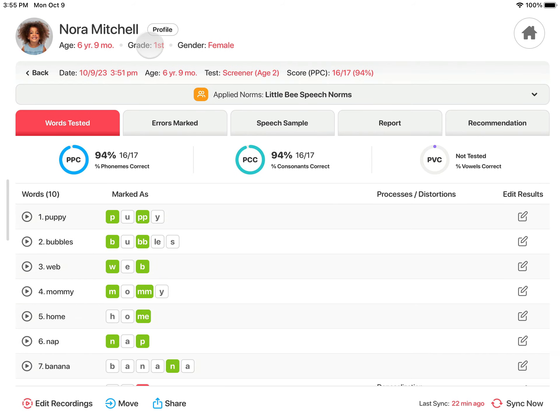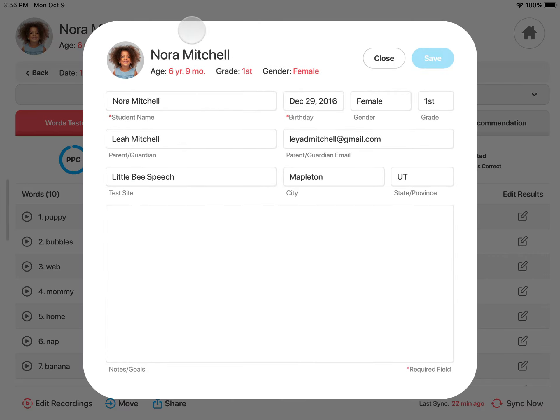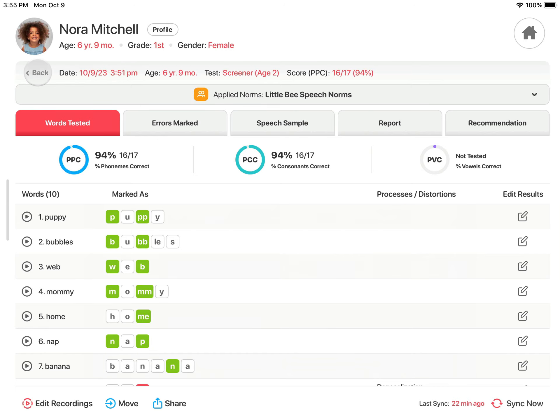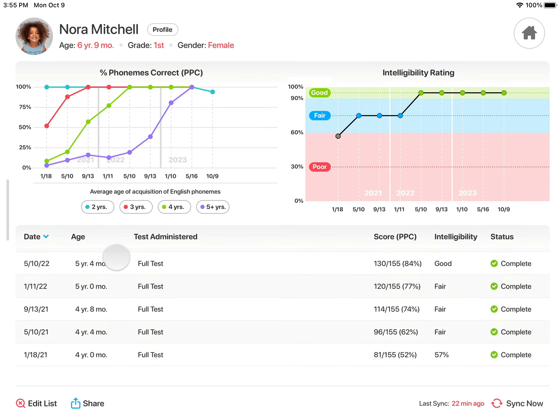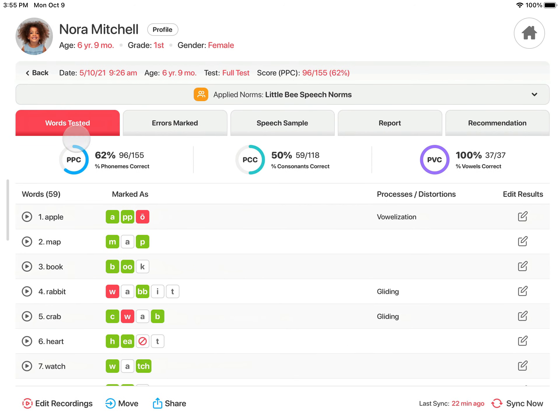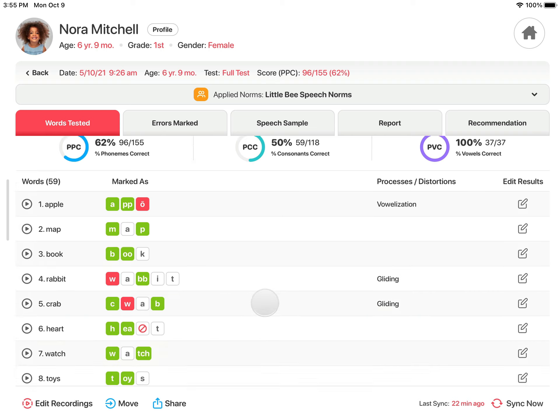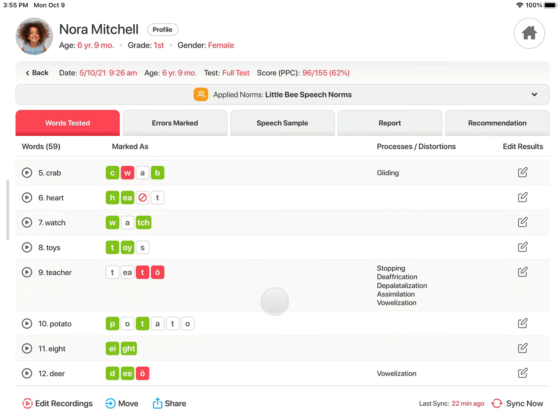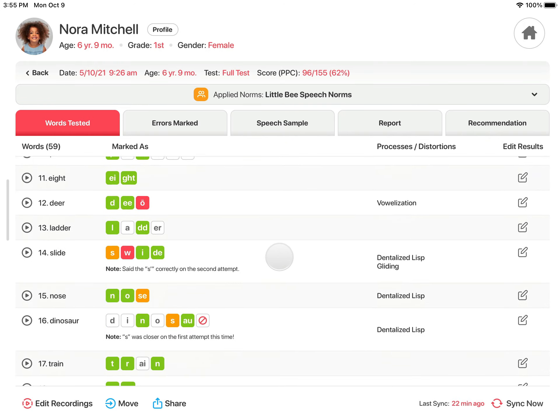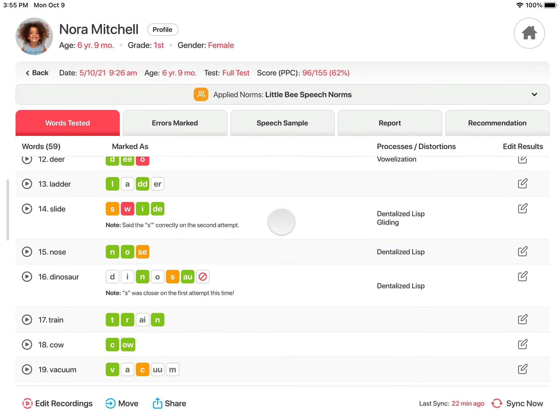Above the test details, you will see the student's information, which can be modified by tapping Profile. The test details start with the Words Tested tab open. The percent phonemes correct, percent consonants correct, and percent vowels correct are displayed. All the words tested are listed with how they were scored, and the phonological processes and distortions marked. You can also listen to recordings and view your notes.